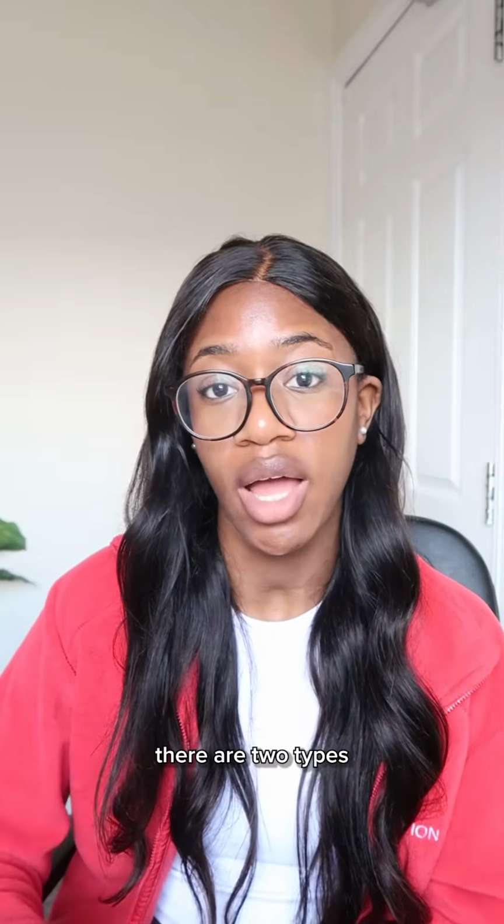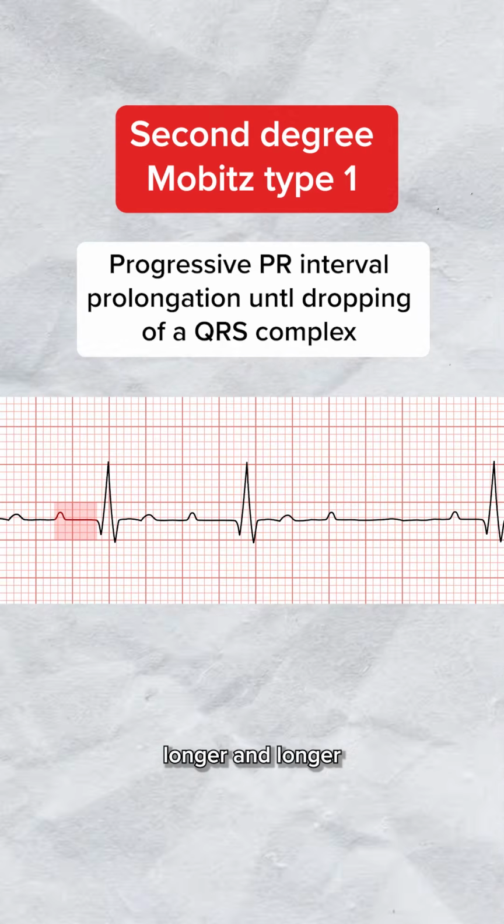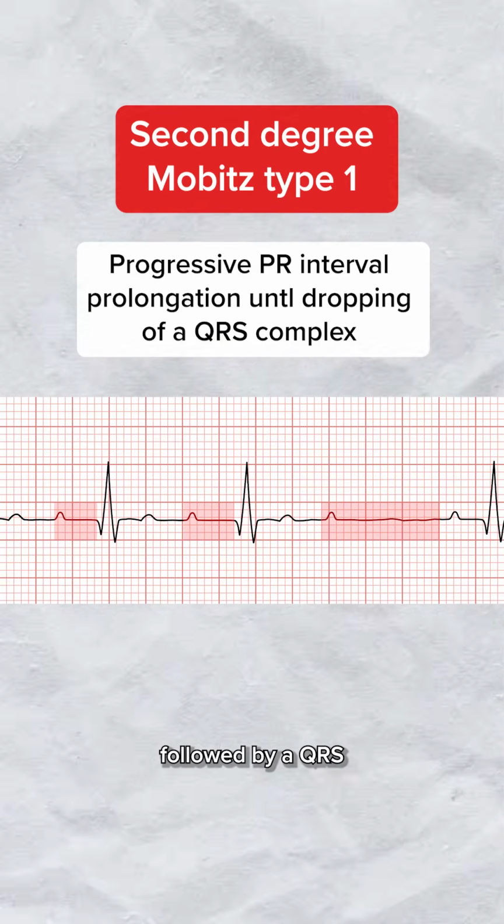In second degree, there are two types. Starting off with type 1, in this heart block, the PR interval is also prolonged, but it gets progressively longer and longer until a P wave is no longer followed by a QRS.